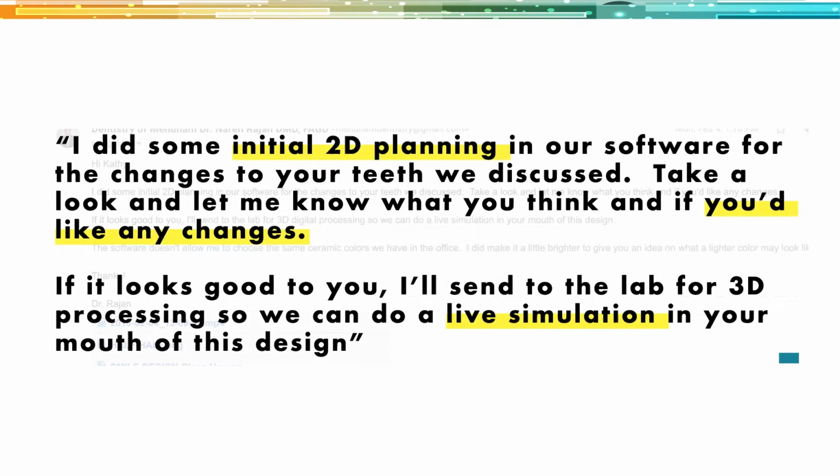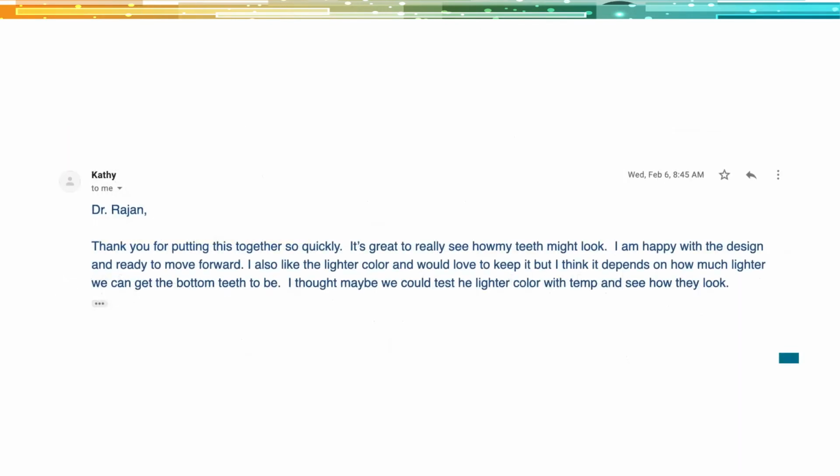I said, Kathy, I did some initial 2D planning in our software for the changes to your teeth we discussed. Take a look and let me know what you think and if you'd like any changes. If it looks good to you, I'll send to the lab for 3D processing so we can do a live simulation in your mouth of this design. And here's what she wrote back.